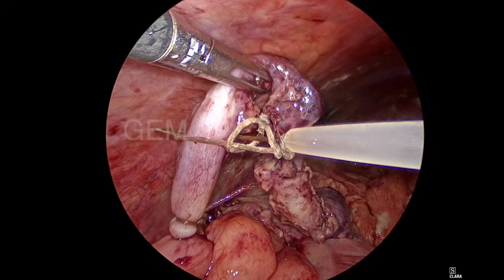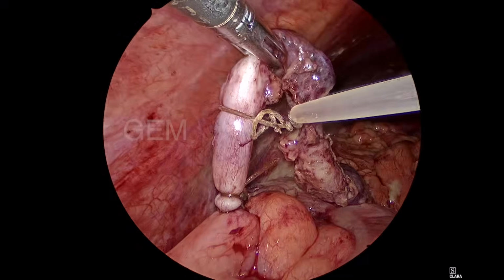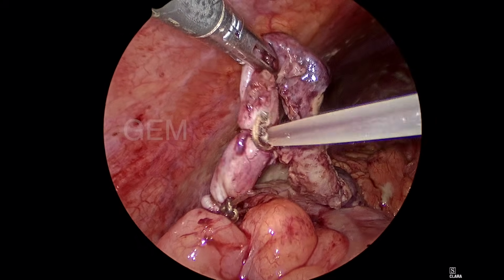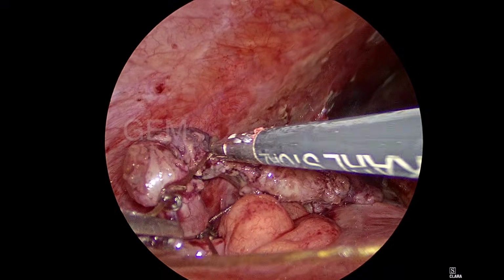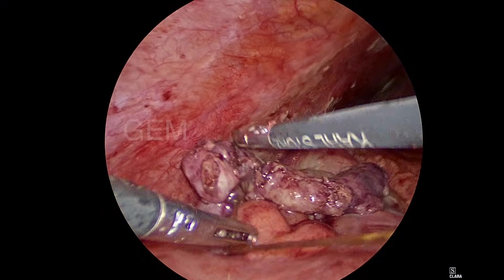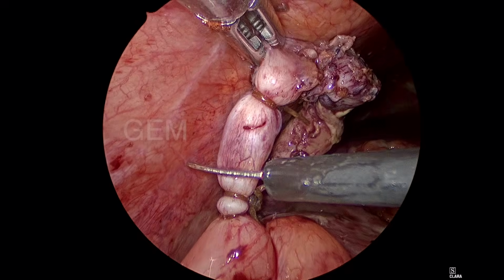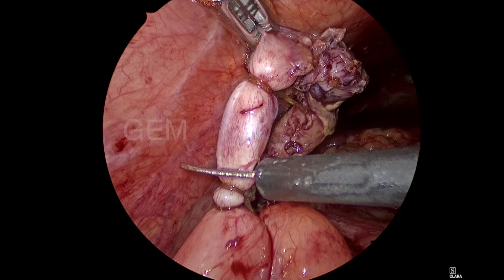So I am just showing that, and you can see this loop you can move up and down very well. You have to make sure the loop does not touch the appendix. If the loop touches the appendix wall, then it will not move. So it is loose, so I tightened it, and actually I put this loop so that the content will not come out from the appendix when I divide it. That is the purpose of this third loop.